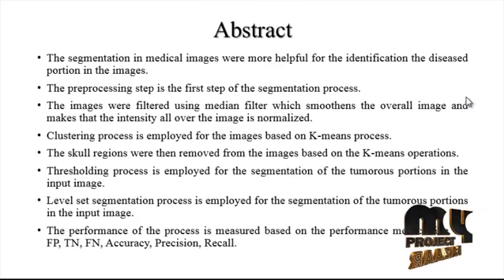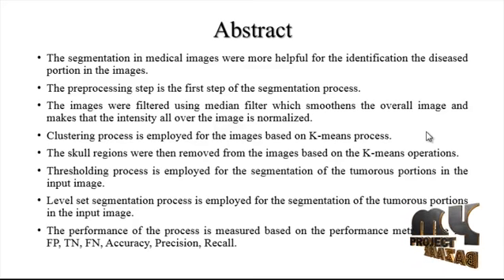Segmentation in medical images is helpful for identifying the diseased portion in the images. The pre-processing step is the first step of the segmentation process. In the pre-processing step we use the median filter. It smooths the overall image and normalizes the intensity.